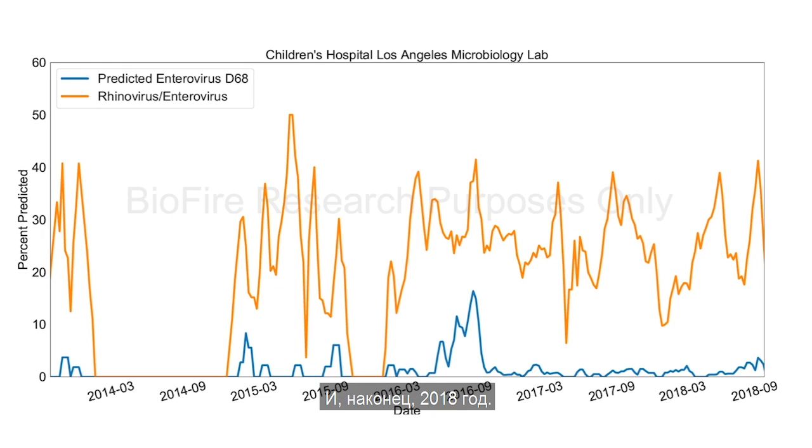And then lastly, this was in 2018. We were monitoring EVD68 very closely in 2018. And so fortunately, we found that the levels of EVD68 in our institution was very low. So we ended up not having to reflex to a manual EVD68 PCR assay to monitor.